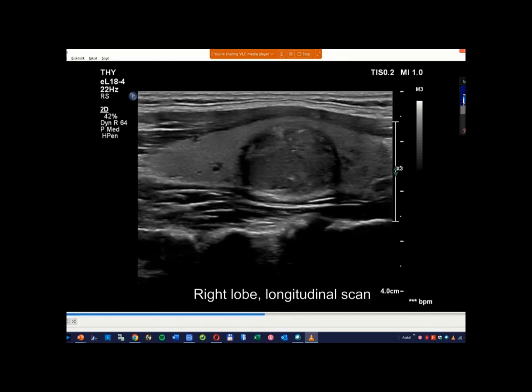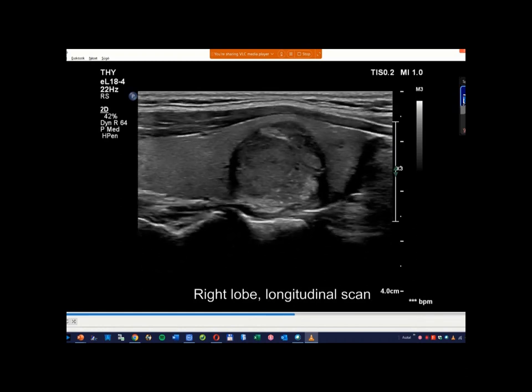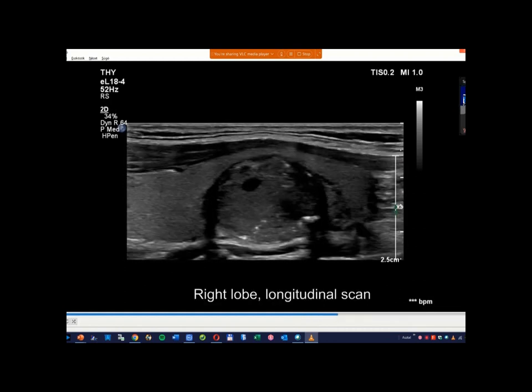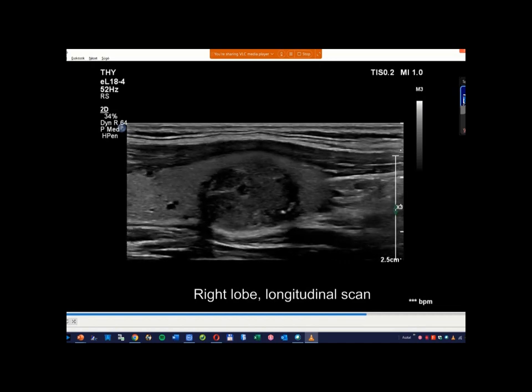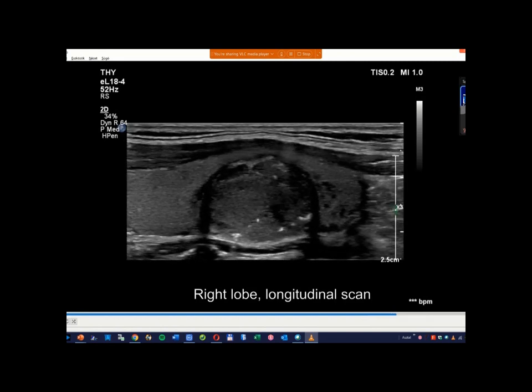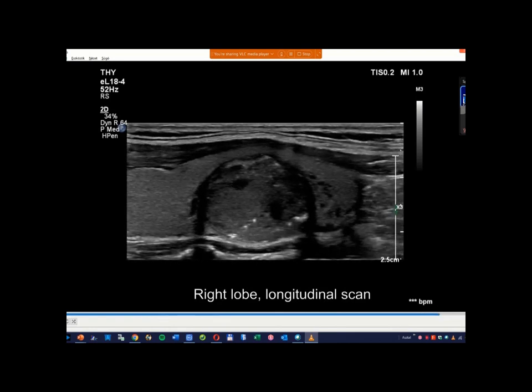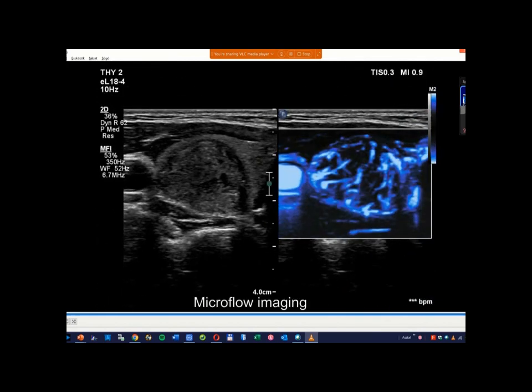Yes, agreed. So if we accept the approach of the Koreans, there were no publications with another opinion regarding the significance of cometary artifacts. If we accept the Korean approach, then we have a very important tool. So there are many quite typical forms of cometary artifacts in this case.